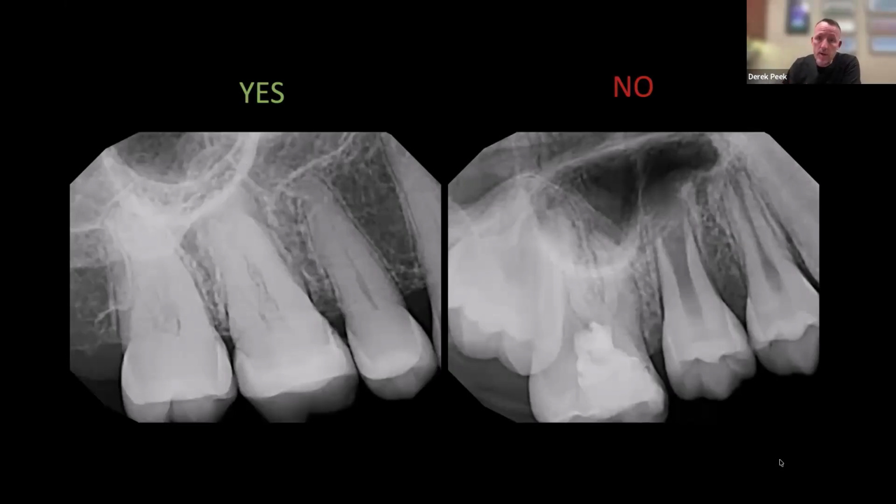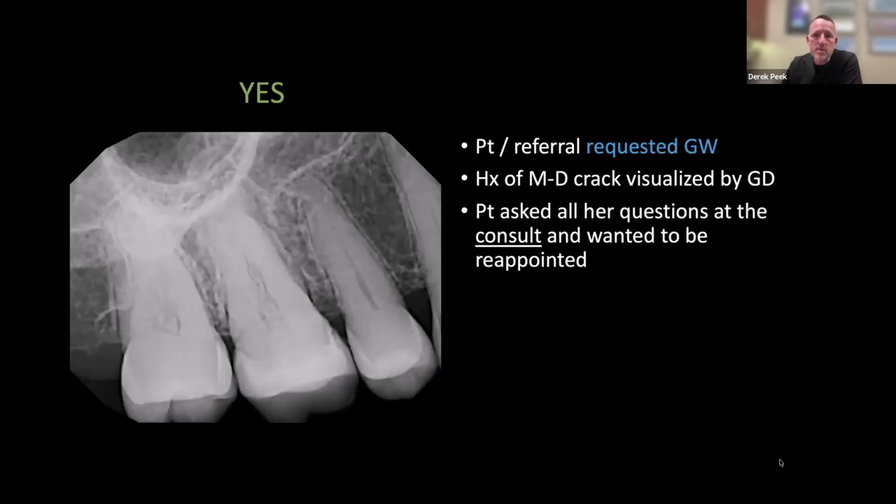But we all know that's really not going to happen because of patient management, or they don't want to sit still for that long. So you look at this one, and she asked all of her questions. There's a history of a crack. She pretty much requested the GentleWave. She'd gone to our website, done her own research, and pretty much told me what she wanted. I was like, absolutely, we can do that for sure.